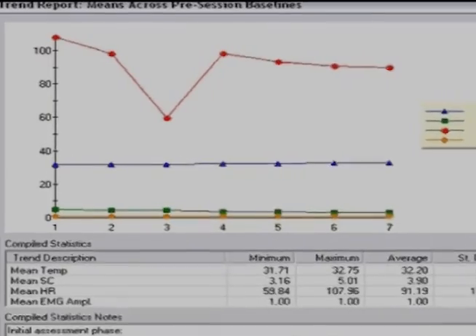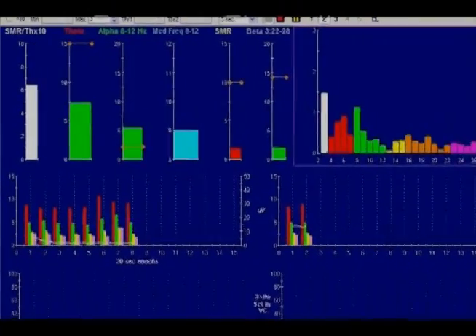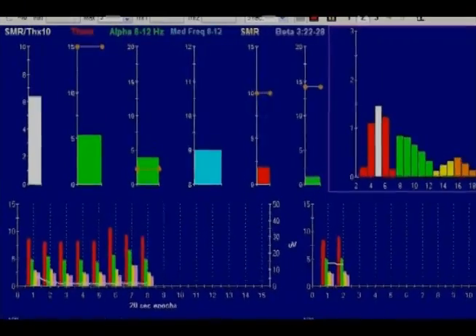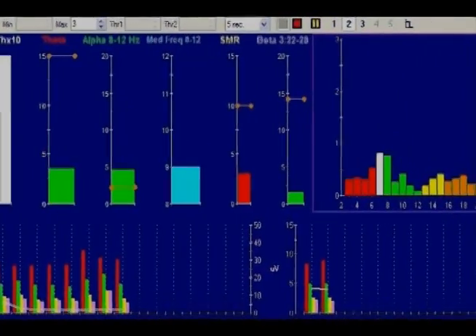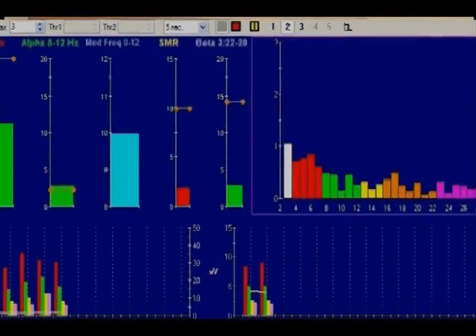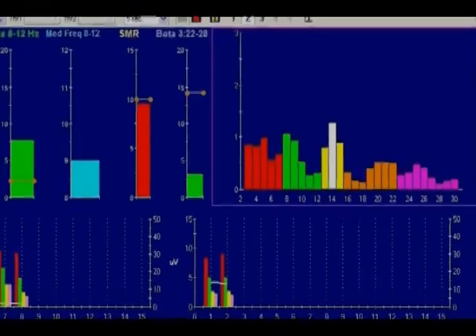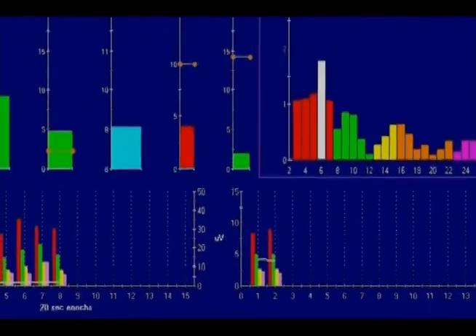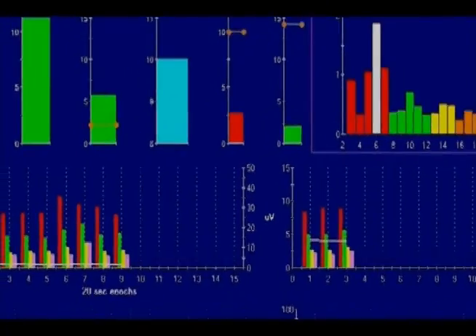Now I'd like to demonstrate some of our screens. This is a screen created for EEG monitoring, biofeedback, and data review. It illustrates the use of bar graphs with proportional tone feedback on the frequency of alpha — the higher the frequency, the higher the tone pitch. In addition to a spectral display, it provides histograms of mean and percent above threshold EEG in four frequency bands for each 20 and 60 second epochs.